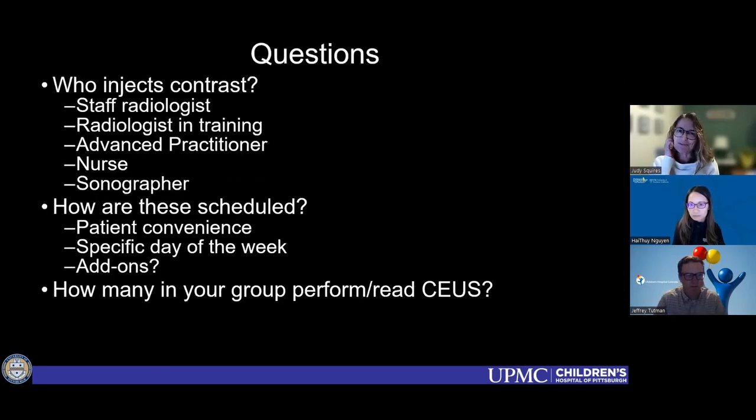So more questions for you guys. Who injects contrast at your institution? Do you have a staff radiologist who is involved with giving contrast, or who does that for you?